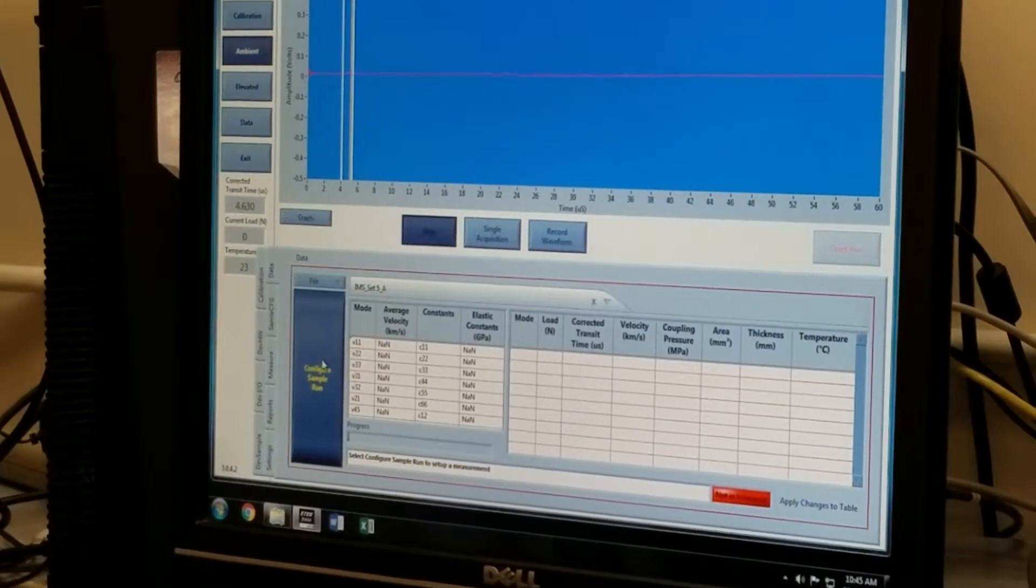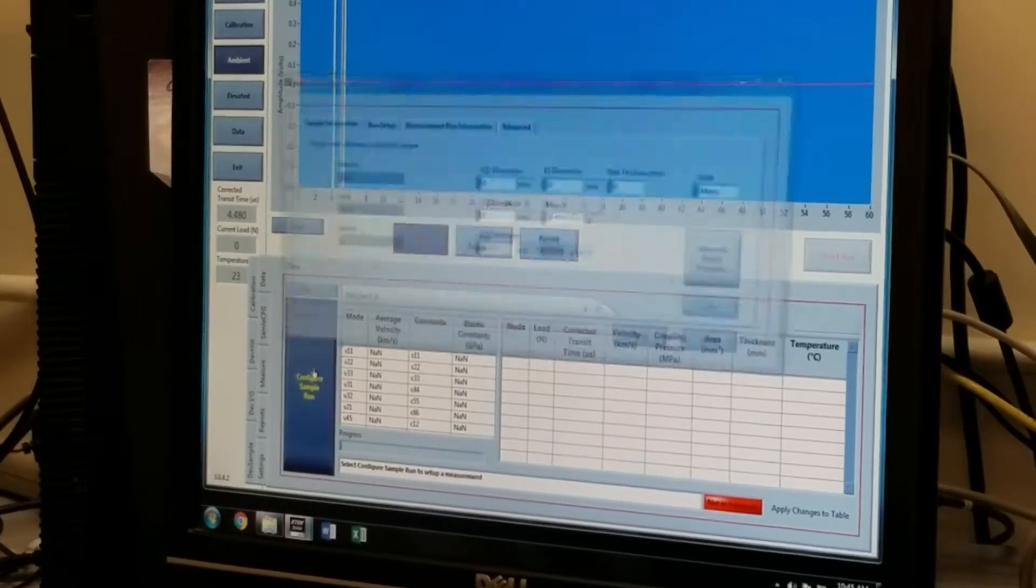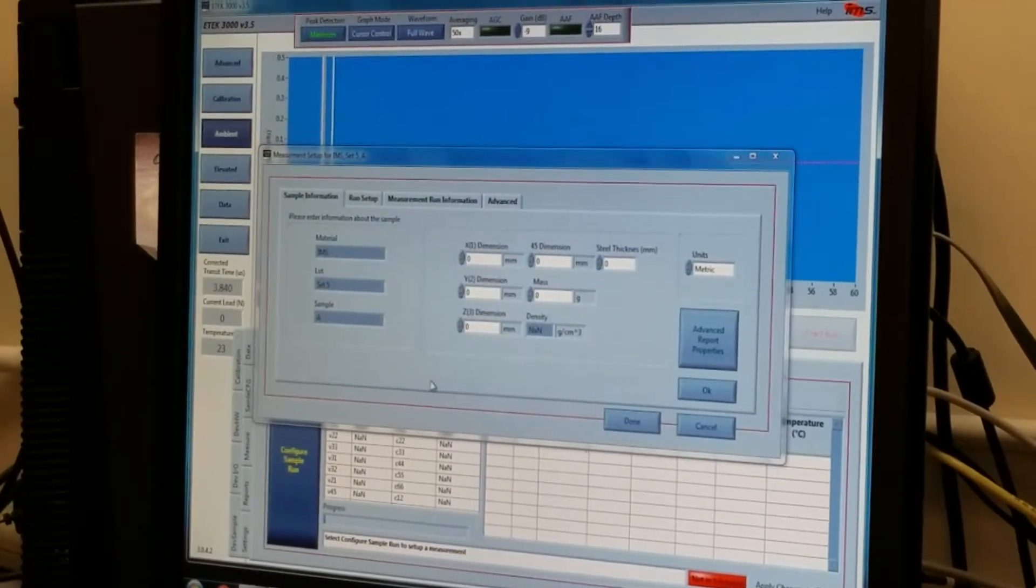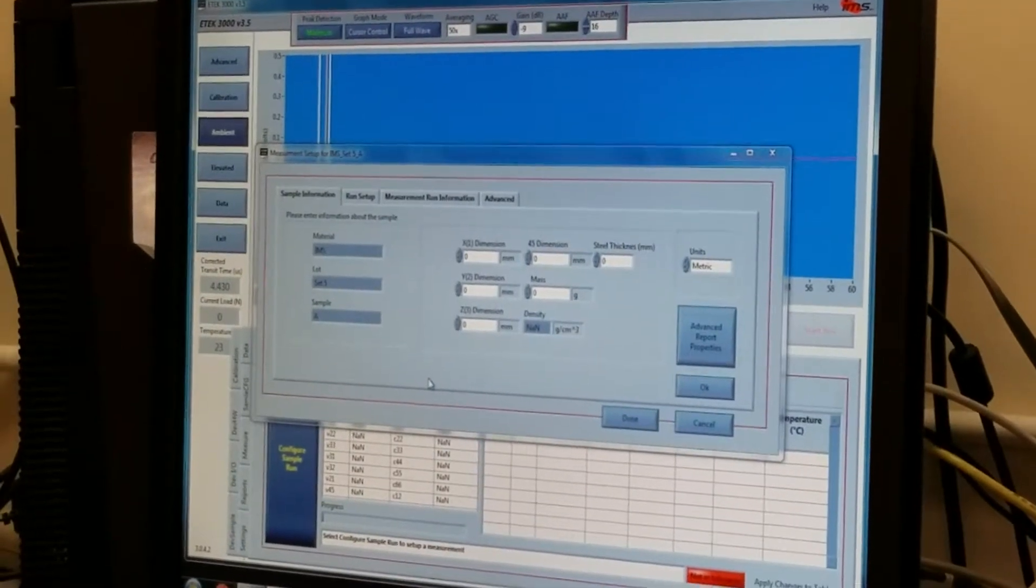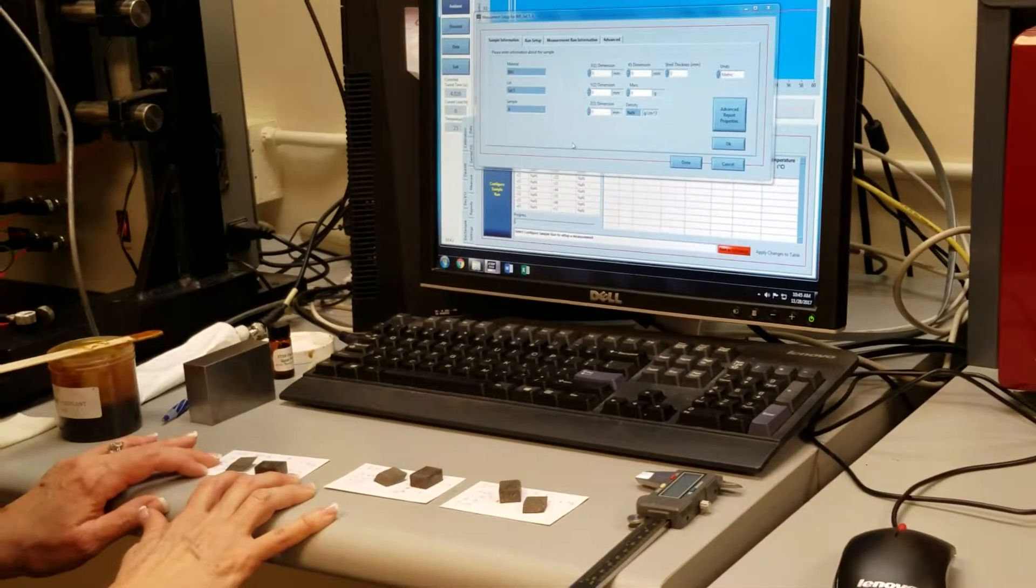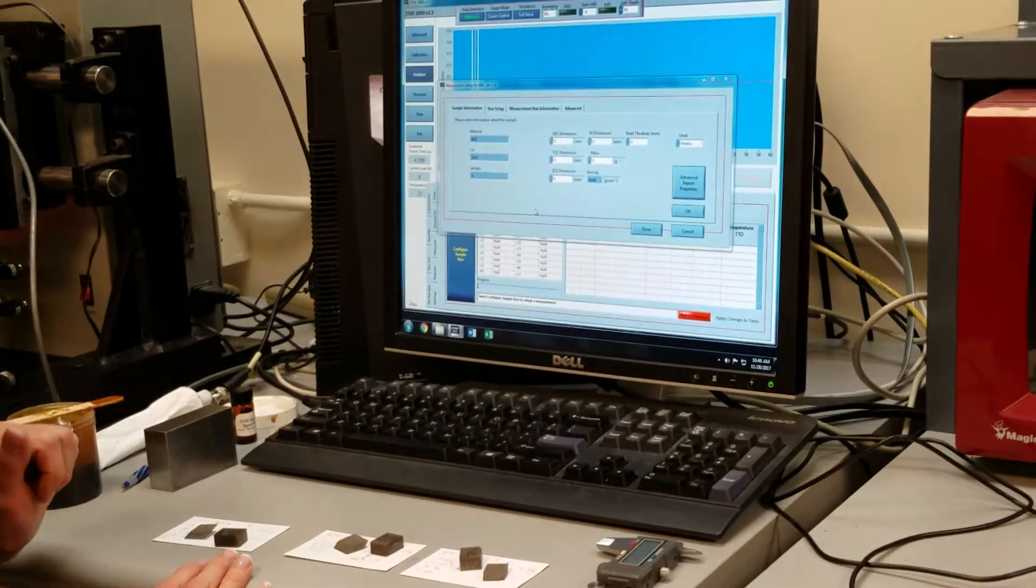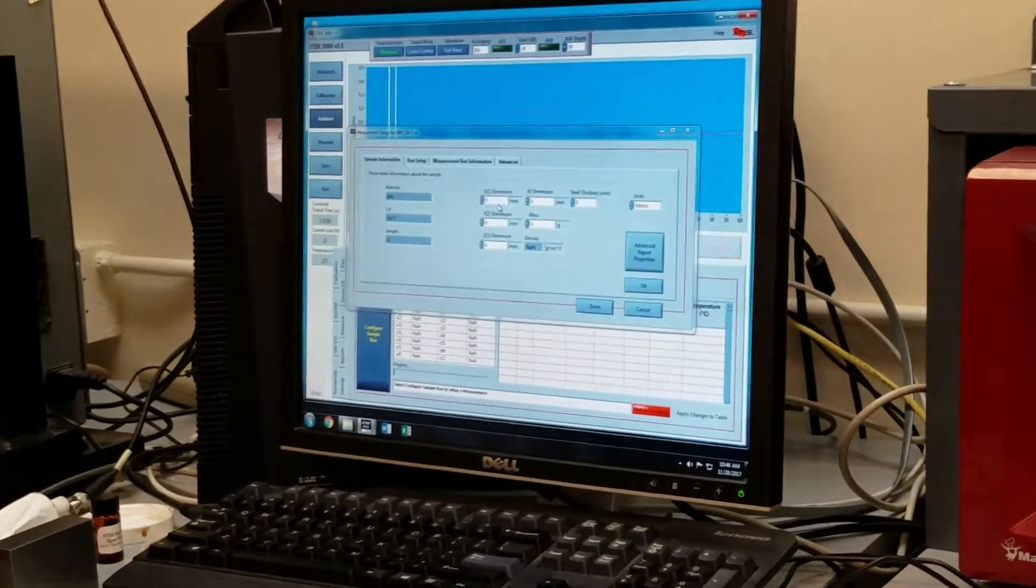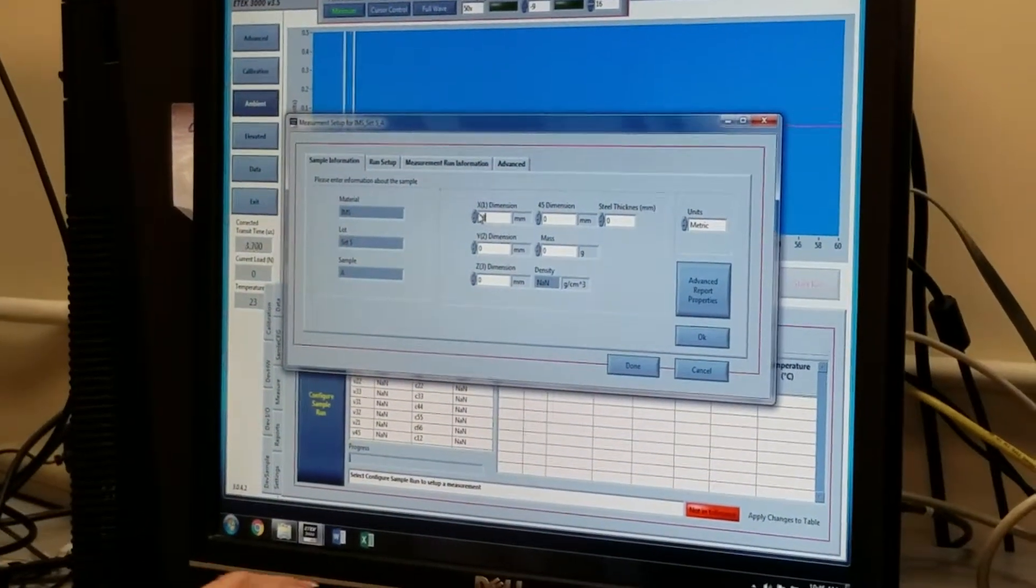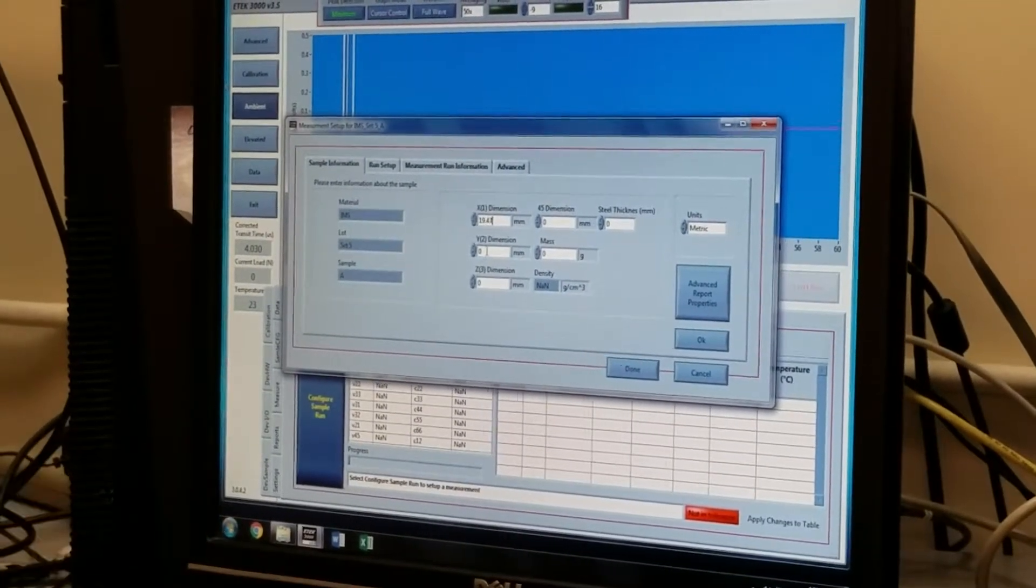The next step is to press configure the sample run, and this comes up with sample information, and I have measured the dimensions of the samples, as well as weighed them, and I need to enter them into this table, starting with the longest dimension, which is 119.47.